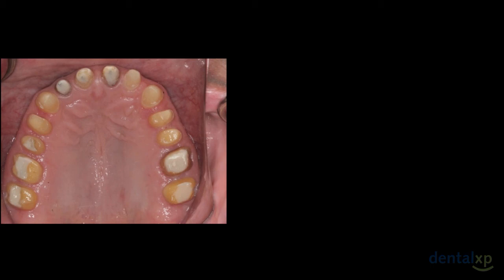Since I've modified the teeth by shaping them, the provisionals are going to be open, and what they will have been filled in with at the time of surgery is cement. So they're not wide open because cement's there, but once you take them off, they are wide open. It is critical to teach your dental assistants about where to reline these provisionals to. They are to end 1 millimeter short of the tissue.